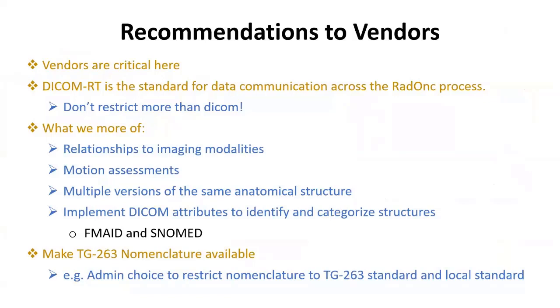You mentioned that it's better to create a structure set for each site, like if you have a structure set for prostate and for breast. But sometimes what I've seen in my clinic is that each doctor creates their own structure set. So instead of having a structure set for a site, we have a structure set for a doctor. I will see in the template a structure set with Dr. A and then a structure set with Dr. B and so on. In my opinion, I think there should be a way to convince doctors to have one language.